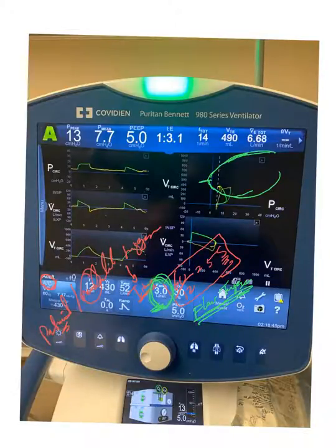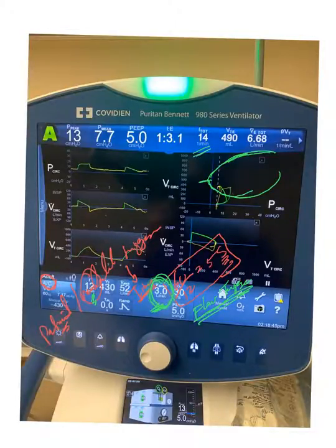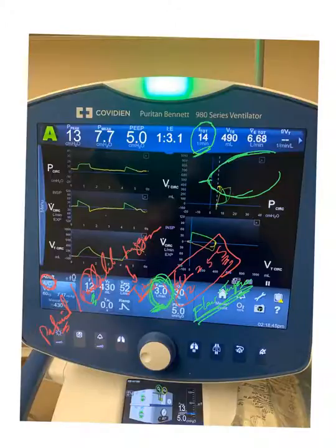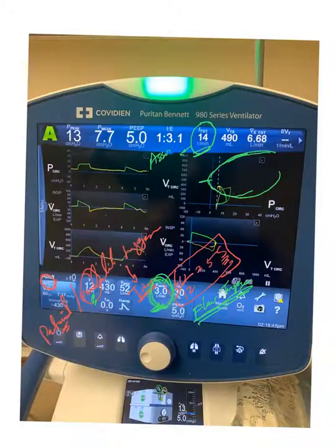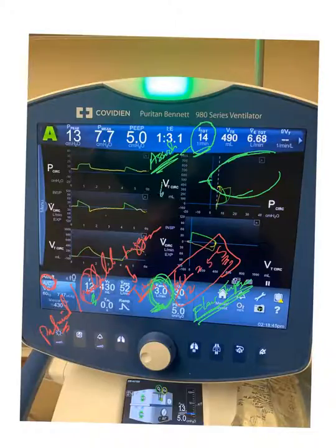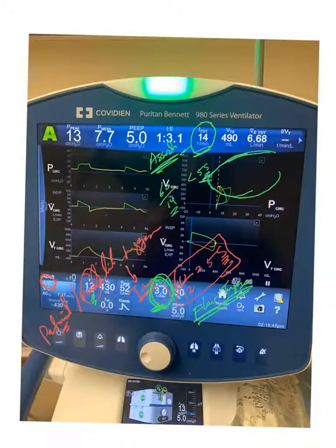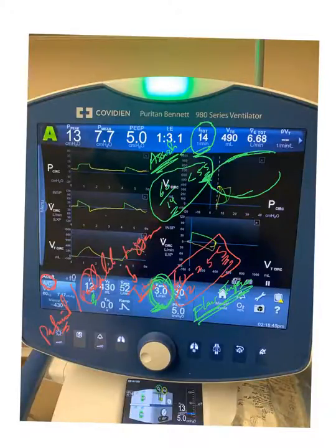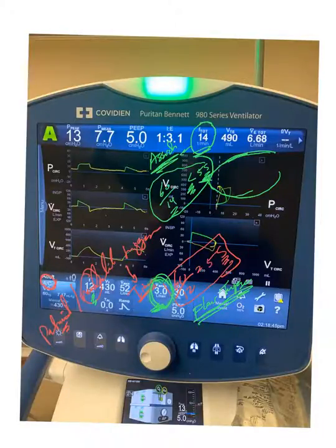The last thing I want to demonstrate: you see the set respiratory rate is 12 per minute, but the actual respiratory rate — where the patient is breathing right now — is 14. Since 14 is bigger than 12, you can guess these are all assist breaths, all patient-triggered — no control breaths. Because 60 divided by 14 is definitely less than five seconds, every time the ventilator tries to reach the five-second mark, the patient triggers before it.